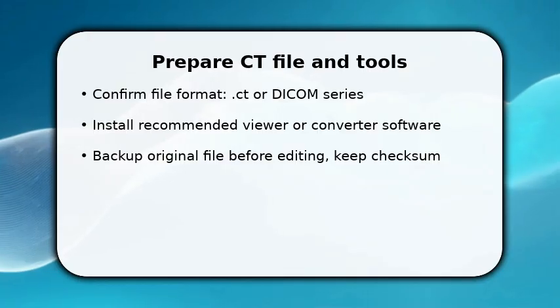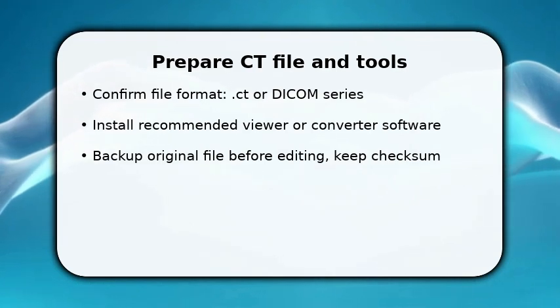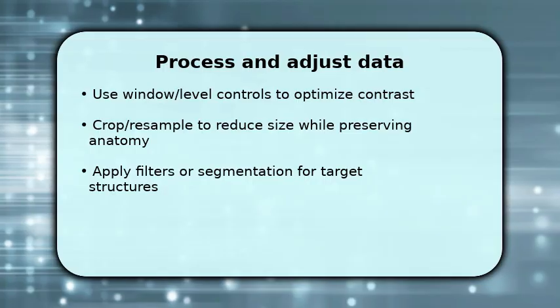This prevents accidental changes. Then load the file into the viewer and orient the display to axial or sagittal views so you can begin targeted adjustments. Once loaded, adjust window and level to reveal the anatomy you need. This clarifies structures for any downstream use.